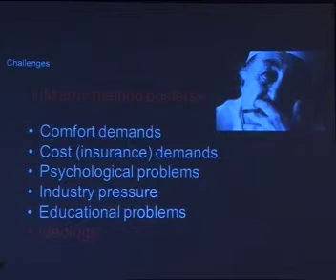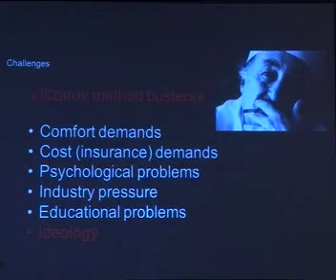So what is going wrong with the Ilizarov method in the world and in our country too? We have what we call Ilizarov method busters. Of course, the first one is comfort demands. People want to get to their job and home very quickly. It's a big problem because we have a frame, and organizing their time around this frame is a hard situation. But anyway, we must think about this.